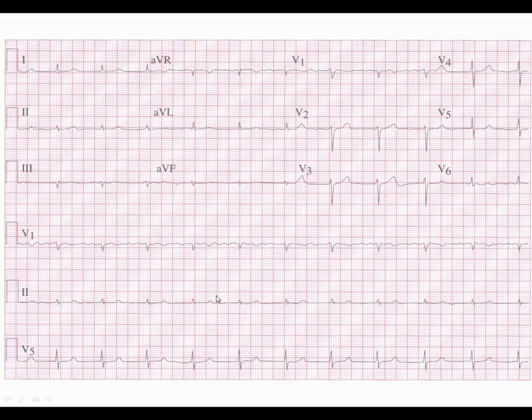Here's a normal 12-lead EKG showing leads I, II, III, AVR, AVL, AVF, and the precordial leads. Looking at V1, notice it's all over the place — the isoelectric line is not flat, it's like a quivering bag of worms. We don't have a regular rate: measuring QRS intervals gives us 300, 150, 175 in one area, and 300, 150, 100, a little over 75 in another — all inconsistent. In another spot it's around 60. It's not regular in any case — this is atrial fibrillation on a 12-lead.